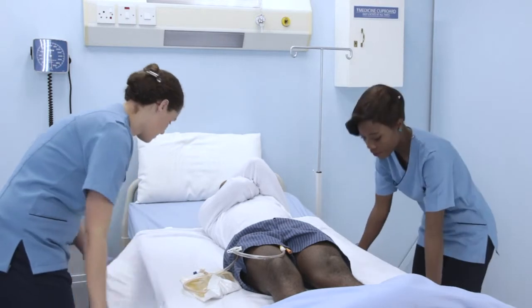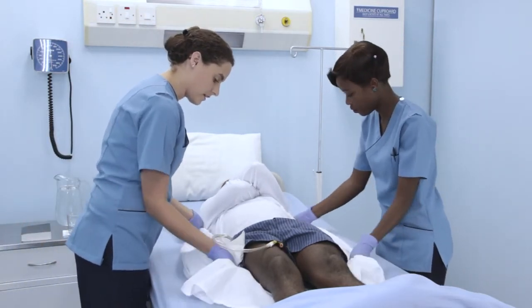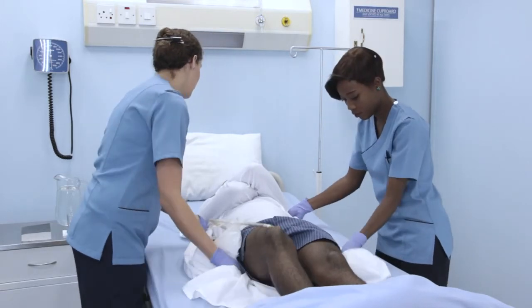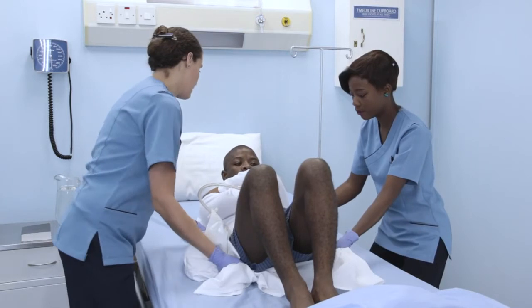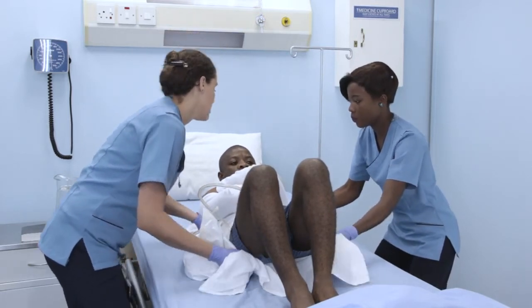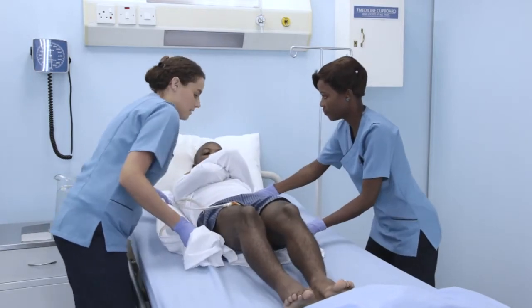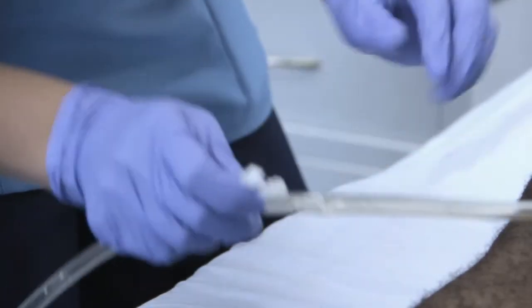Move any tubing, lines and collection bags with the patient during the procedure. Remember to unclamp the tube after completing the procedure.